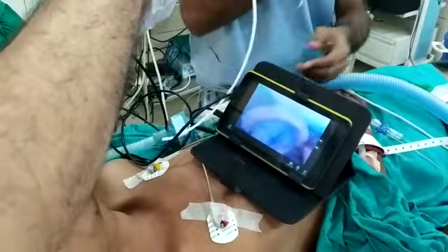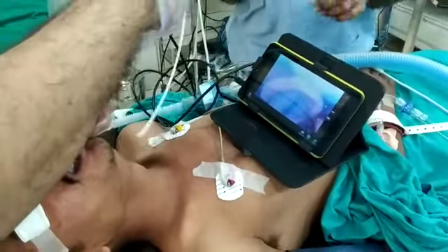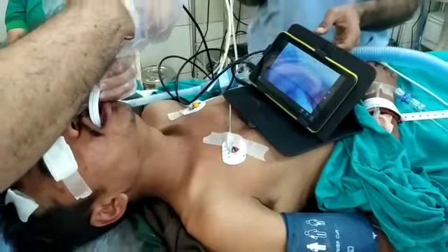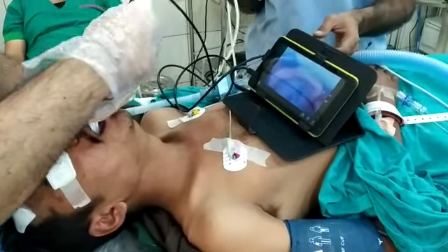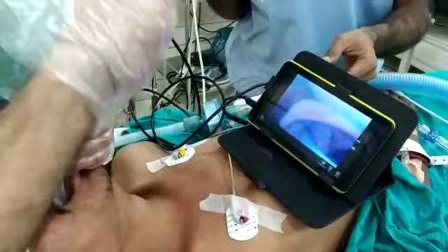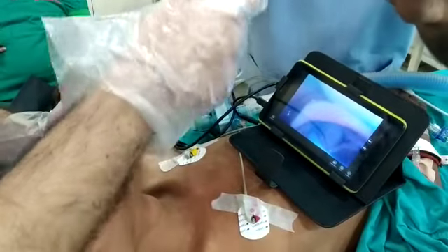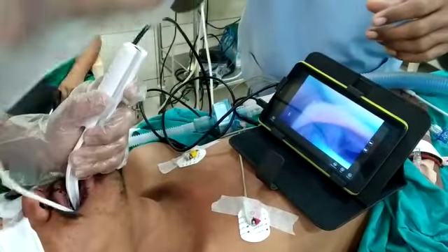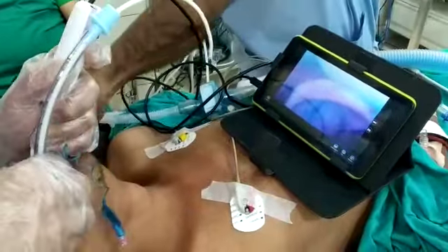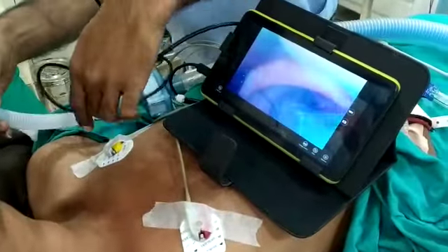Now I am further introducing the bougie. The bougie has entered the larynx, and now over the bougie we are loading the endotracheal tube.